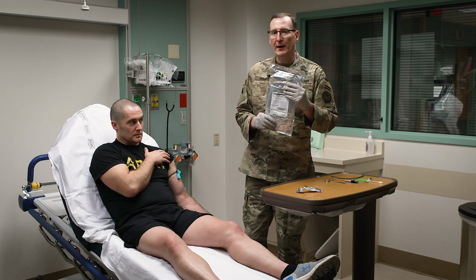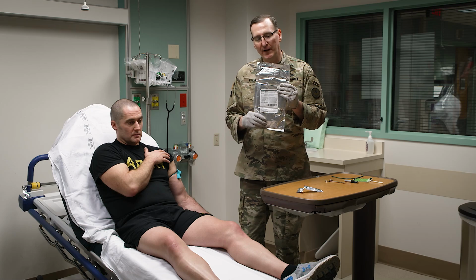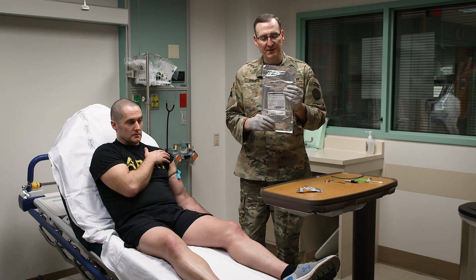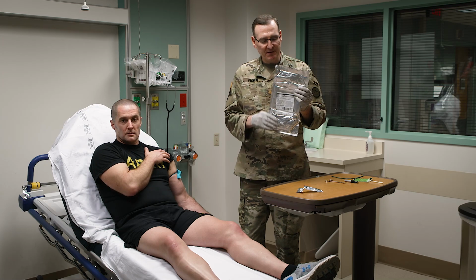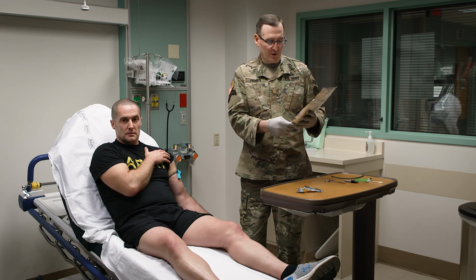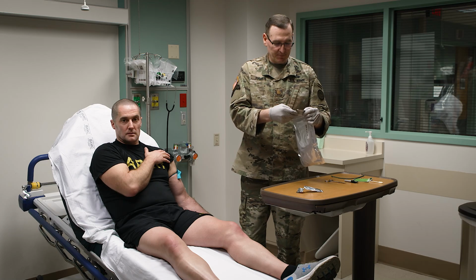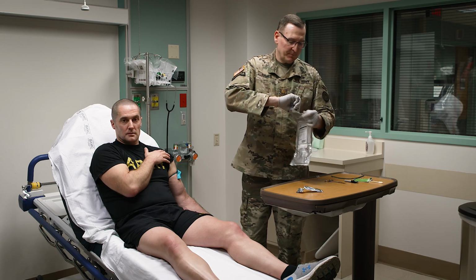In the meantime, we can talk about the blood transfusion bag. This type of bag that most likely you'll find in your fresh whole blood collection kits comes in aluminum packaging like this. You can look for the expiration up here. It says July 24. You can also find it down here where it says the date of expiration. Go ahead and open it.